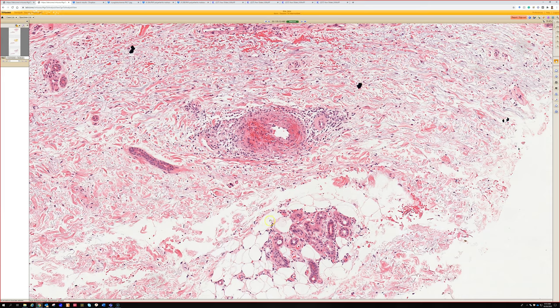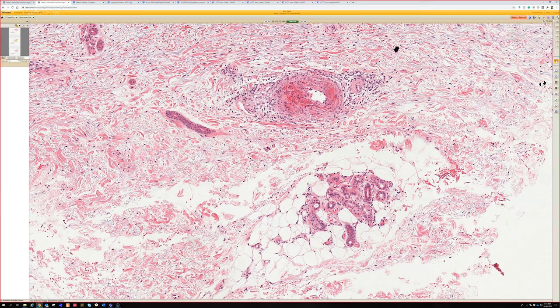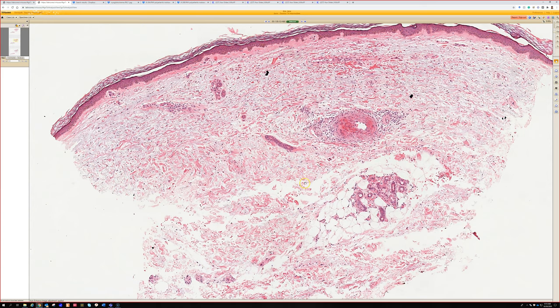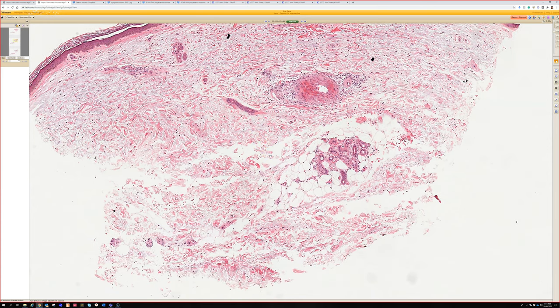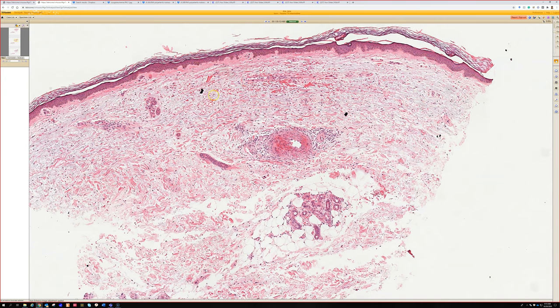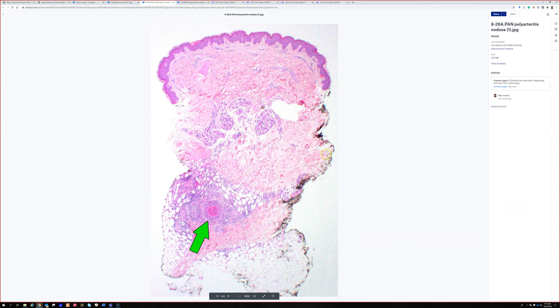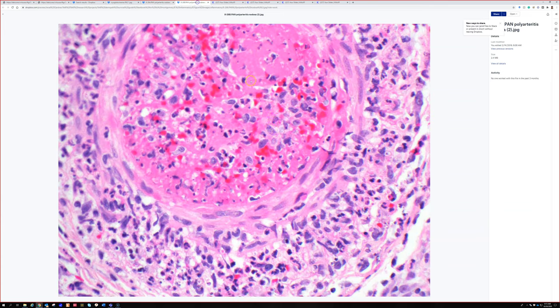From all the cases I've seen, it's always like one vessel with really obvious LCV and you don't see multiple vessels — I usually only see one cross section in one punch biopsy. Here's a more typical example: the vessel is really prominently inflamed, packed full of an organizing thrombus, with destruction of the vessel wall, right down at the dermis-subcutis interface. You can see fibrin and various inflammatory cells including neutrophils, and the vessel wall has got neutrophils and it's beginning to get destroyed by inflammation. That's a pretty good example of polyarteritis nodosa.